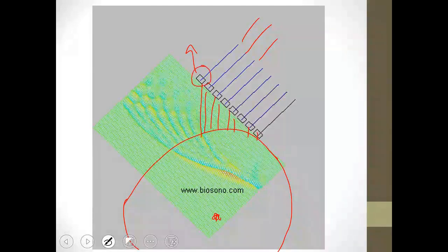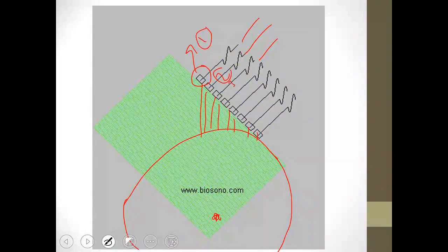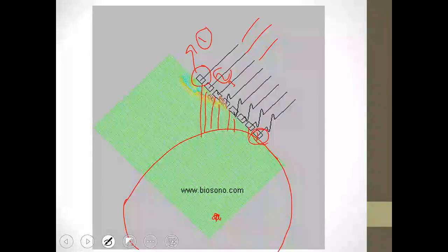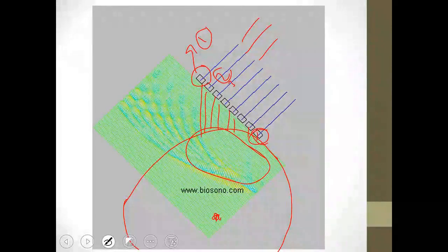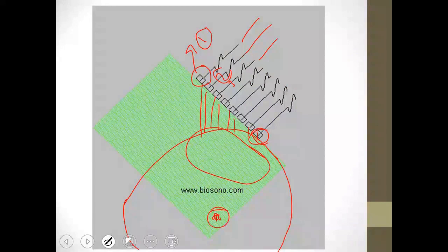And this time is what you use to send the signal to this element, number 1, then 2, then 3, then 4, and so on, until you reach the element that is already on the surface of your circle. The interference that will occur will be more focused on the focal points you want to capture, which are the beginning of your field of view.